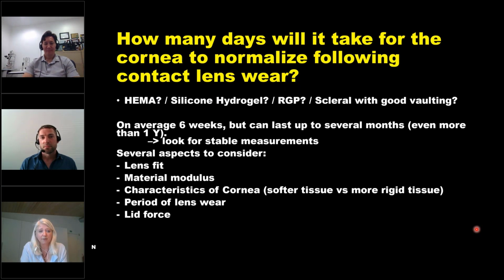No. If we are so lucky, sometimes the practitioner working on this patient has some old data, for example old K readings or something that we can compare with the results, and that is of course helpful. But otherwise there's nothing else to do than just wait until you can do 2 similar captures with some days between. You really can get surprised at how long it can take before the cornea is normal.